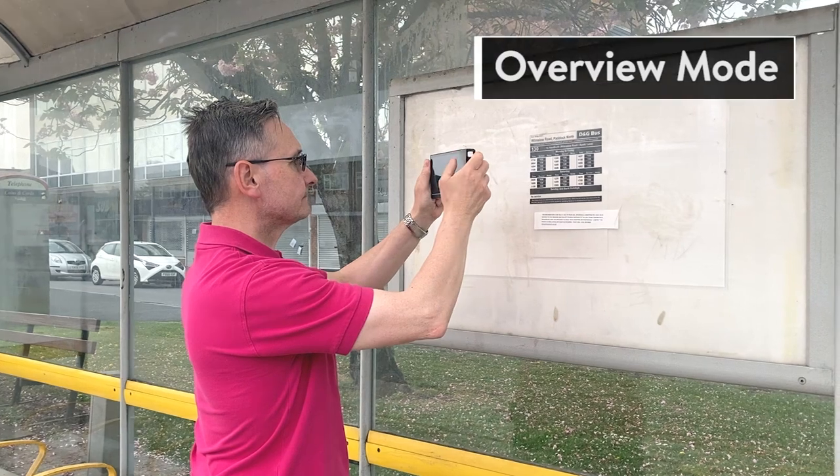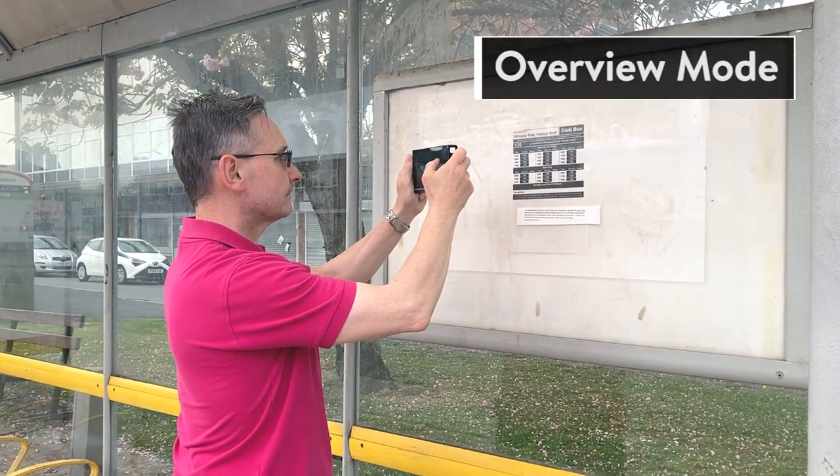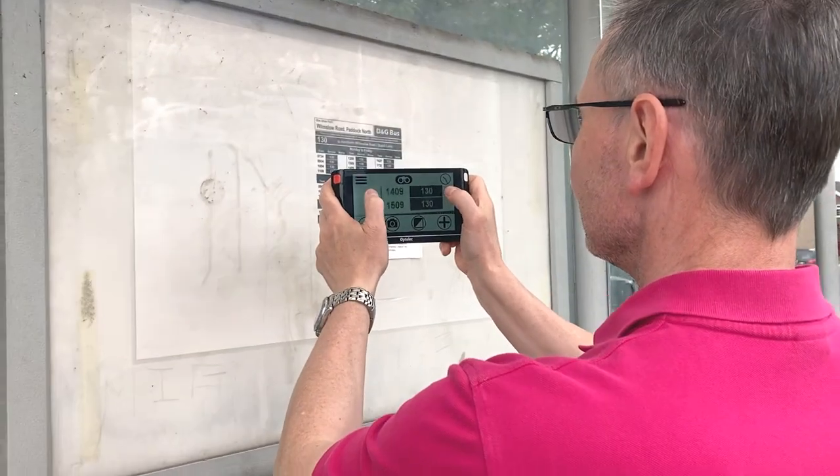You can do some distance work by taking it out of the holder and then you can look at things like bus timetables, the pub blackboard with the lovely specials on it, things like that. It really covers two bases.